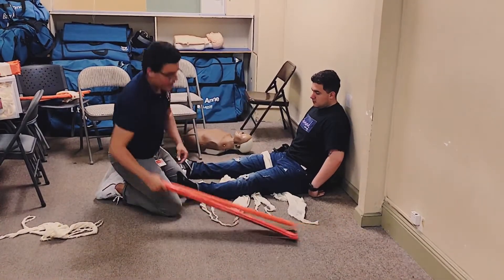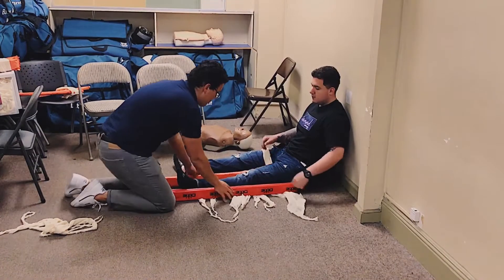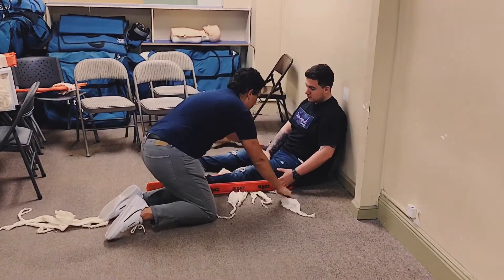I'm going to have my patient assist in stabilizing the long board, soft side to the patient. I'm going to go ahead and begin tying my cravats.